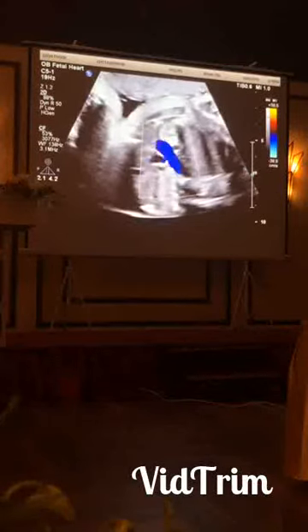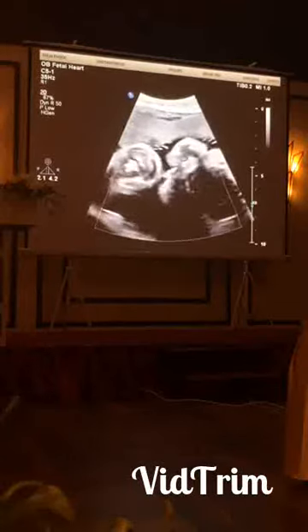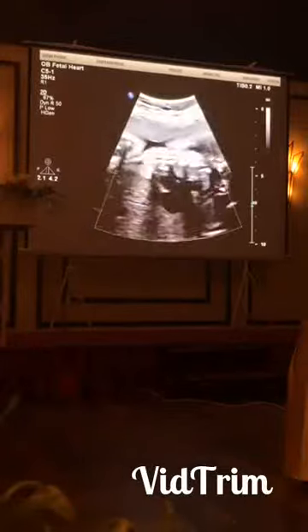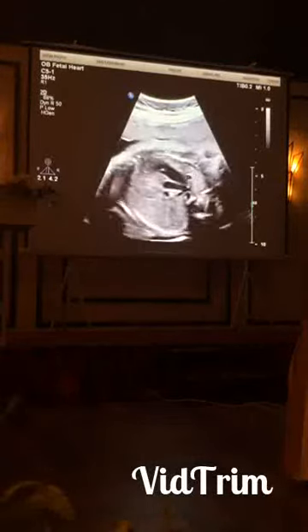And is it possible to get the sagittal? Yeah, try this now. I think the case is a little bit confusing, because we just said a couple of minutes, maybe hours ago, that LSVC is not associated with coarctation. You can see there are 4 vessels instead of 3.